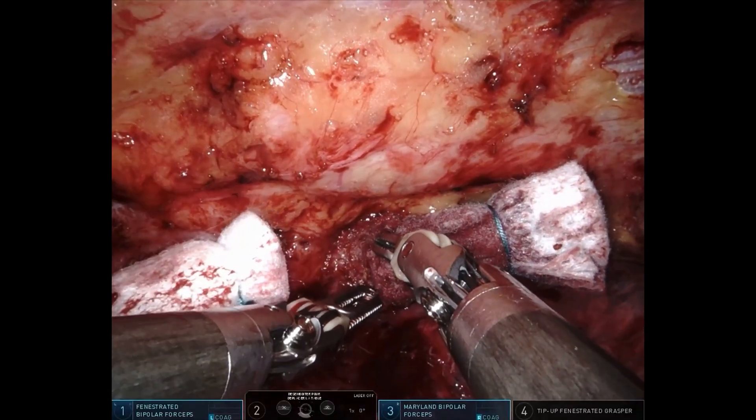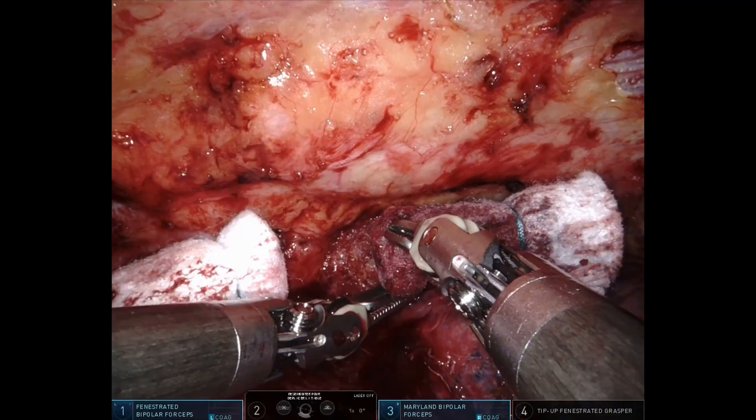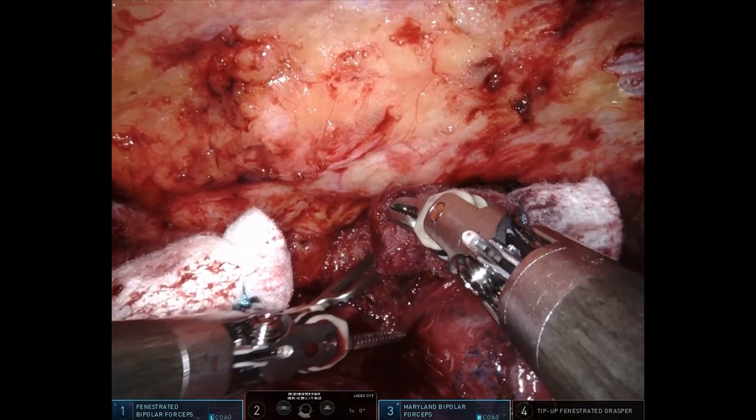After the recommended compression time, the gauze is gently removed, revealing complete hemostasis without the need for sutures or additional interventions.